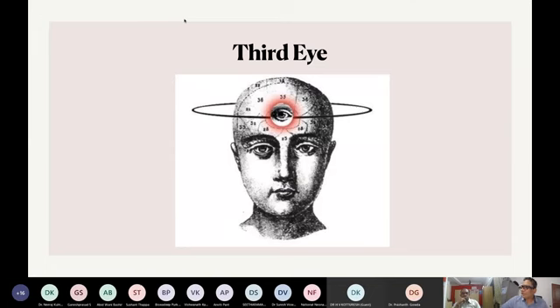Now, I personally have used transillumination since I was a trainee in London since 1998-99. And I personally feel that it is my third eye, because my normal two eyes are fine enough. But without the transillumination devices, my success rate in IV cannulation and peripheral PICC line insertion comes down significantly. And with the transillumination device, my success is very good. So that's why I call it a third eye.